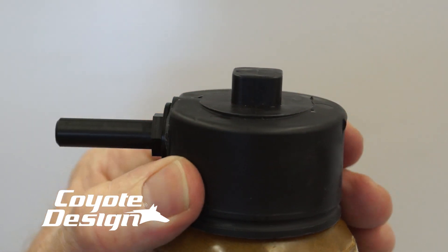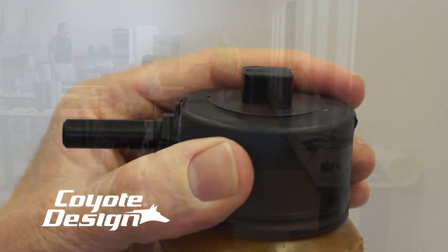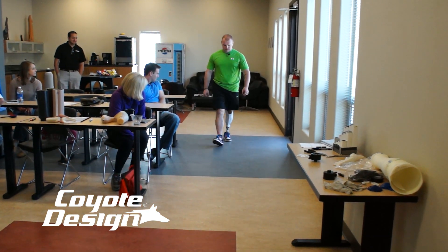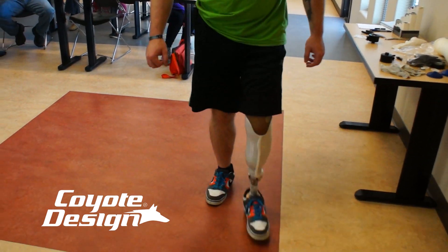Coyote Designs Airlock is a unique patented system that creates suction to hold the prosthetic in position, making it feel more secure, helping to minimize pistoning inside the socket, and increasing a feeling of stability.